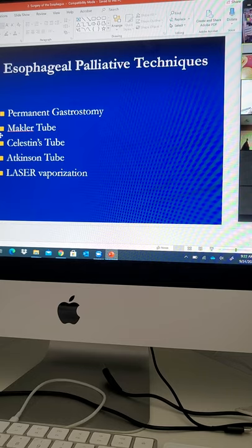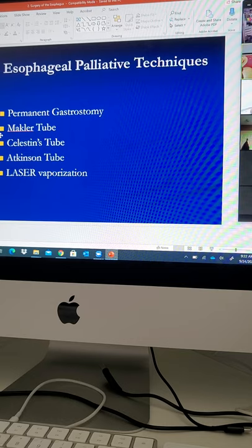You have different types of lasers, YAG, argon, CO2 lasers, and you have to have a laser nurse. The nurse is specifically operating this machine. So that's gonna be circulating nurse, laser nurse, attached with the wet sponge and the goggles, and also you need to have an extra pair of goggles on the door in case somebody needs to come in the room, and you have to have a sign on the door, 'Laser in use,' a big sign, danger, laser in use, all right? So that's for all your protection. You have to put the count or the time for how long the laser was used. All right, so let's go to the next part.